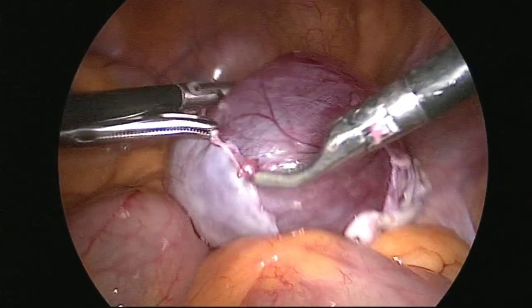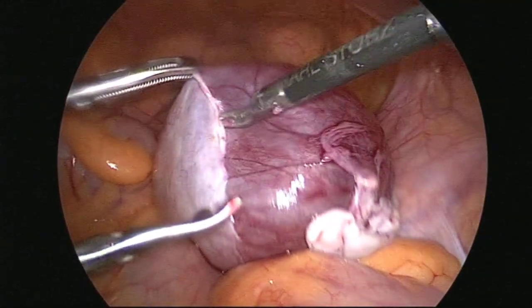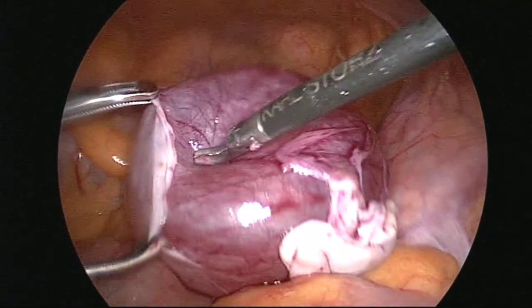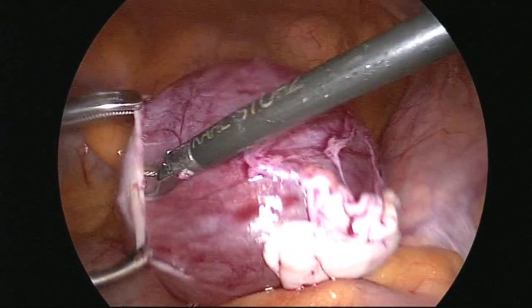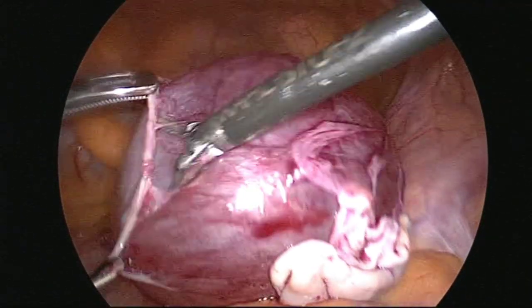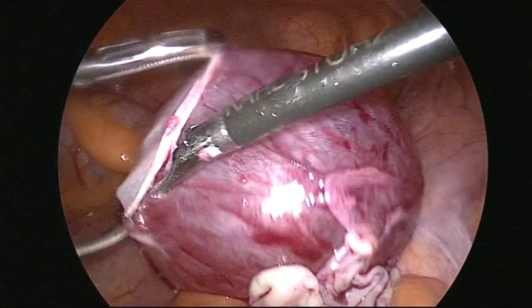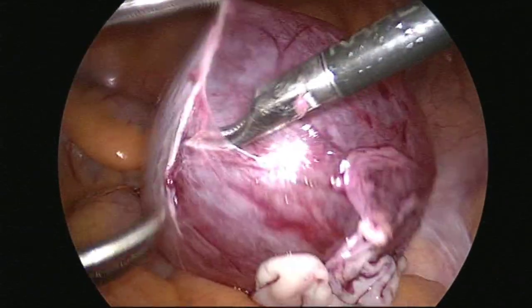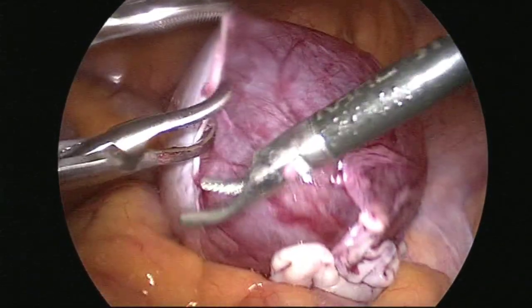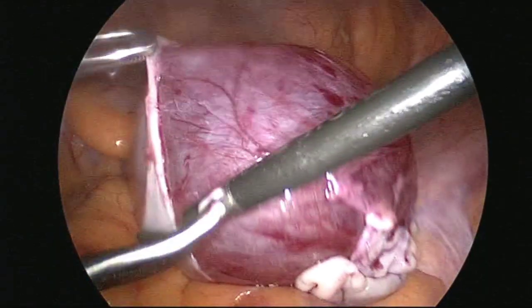But if I use the toothed or any other instruments, then there is high possibility of rupture of the cyst. That's why I'm not using that. Now I will separate it slowly and slowly in the right plane. Remove this fiber. Go on.